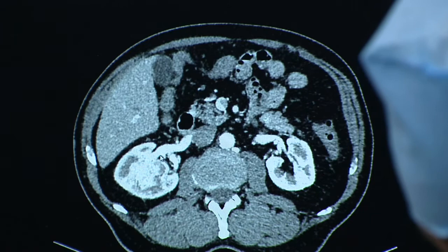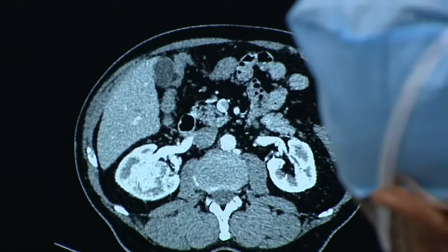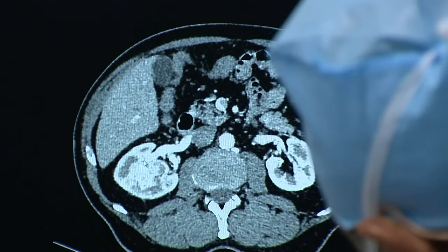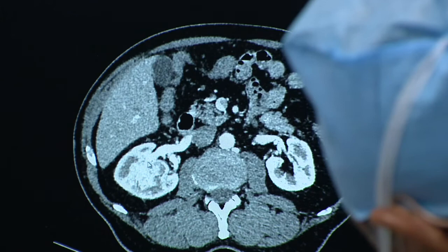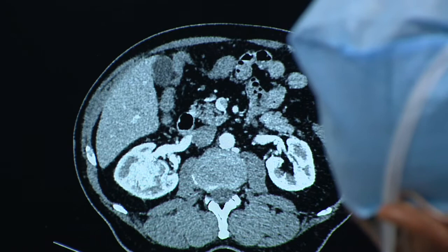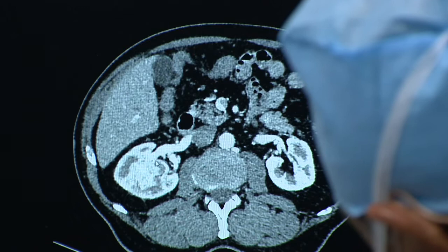Here is the main renal artery, literally at the interface of the tumor and the kidney. See that? Here is the tumor contour, that is the kidney, and this is the kidney-tumor interface, and the main renal artery is right there. To save this kidney, this artery will need to be saved, or otherwise this kidney is non-viable. Here is the posterior branch. Now, here is a little circumflex branch that looks to me like it's right on the edge of the tumor, if not actually in the tumor.